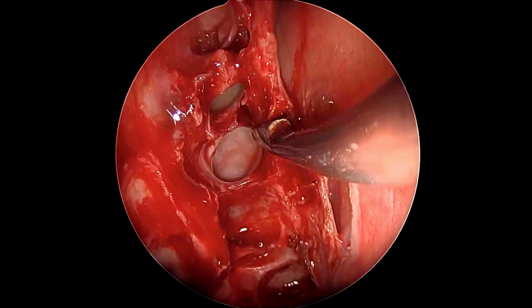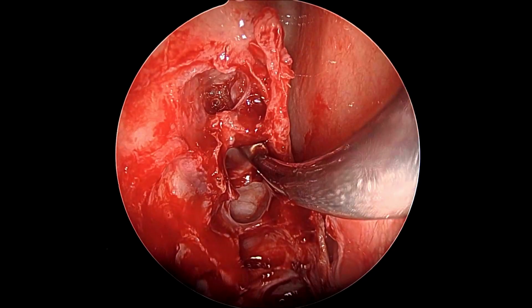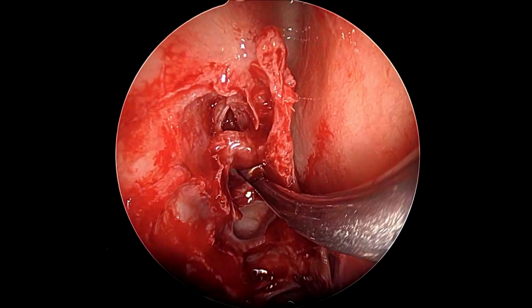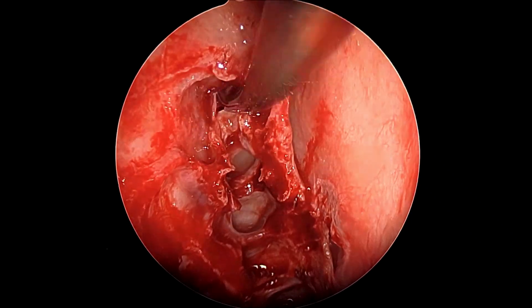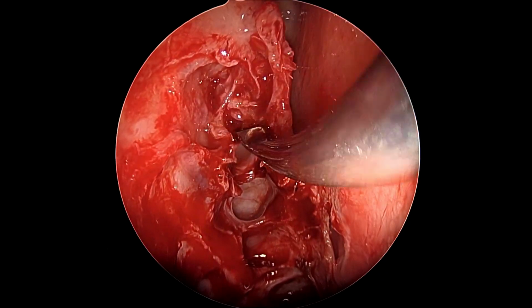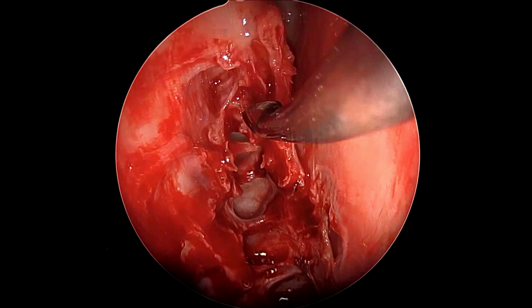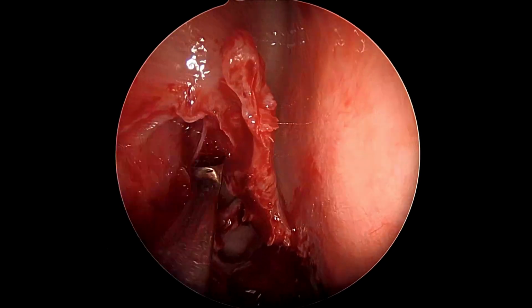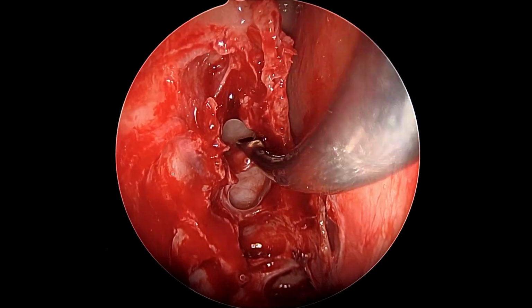Working very close to the skull base, one must try to avoid using too much force on the curette or fracture too hard, because that can sometimes also create new defects or CSF leaks, which is counterproductive. So whenever somebody feels that the force required to push on a cell or on a bony partition is excessive or uncomfortable, it is wiser to resort to drilling using a diamond burr rather than to use a curette.